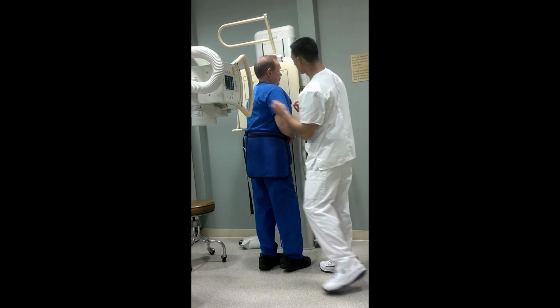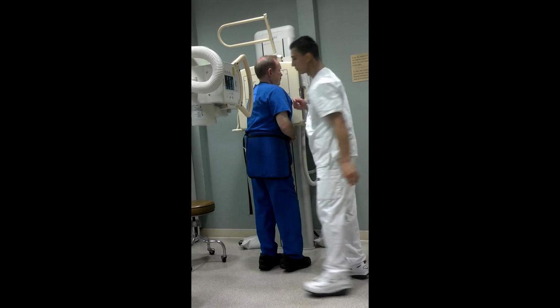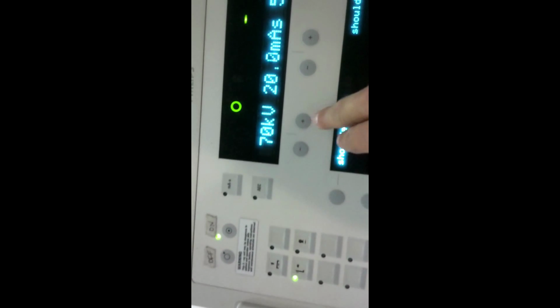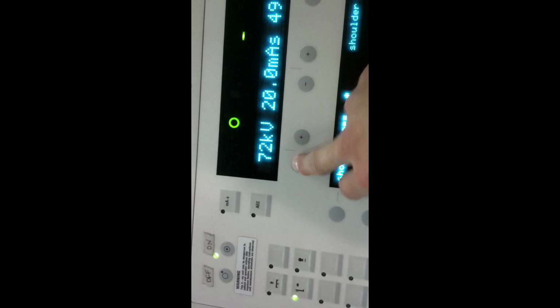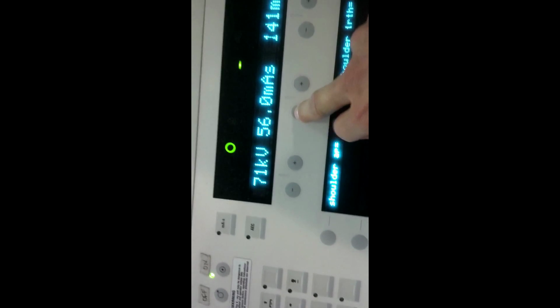Get our marker in here. Got the left marker in there, and it looks like we're all set to go. So we'll come over here to the console, and I will be shooting this bucky at about 71 at about 50 on this console, and that's all.